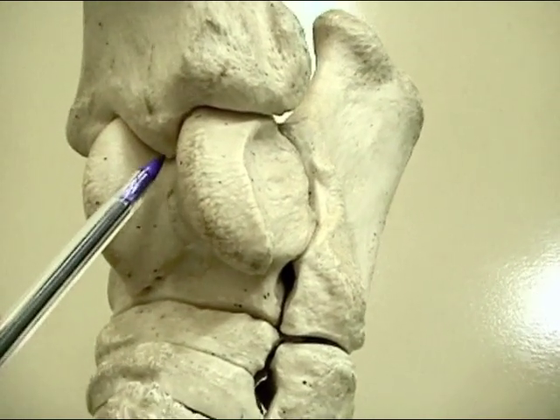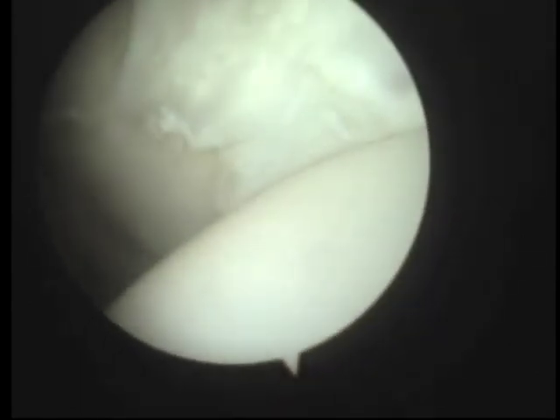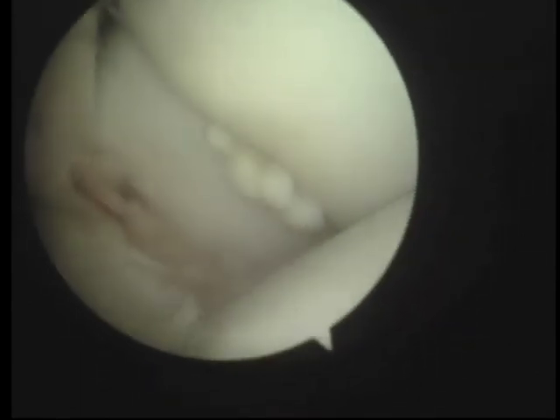Our camera's going to be going in and looking at that part there. In we go to the top of the trochlear ridge, which is there. That's all just soft tissue, so that's all normal, and that's the bone. We're going to cross there and there's the fragment that we're going to take out.